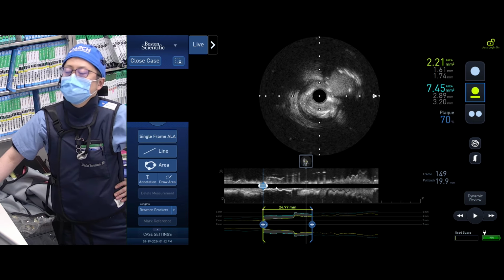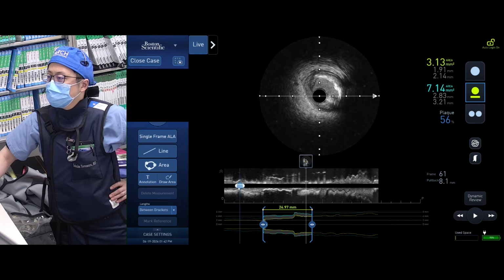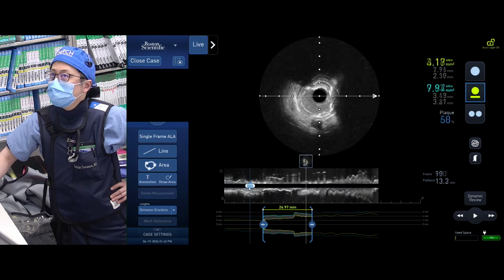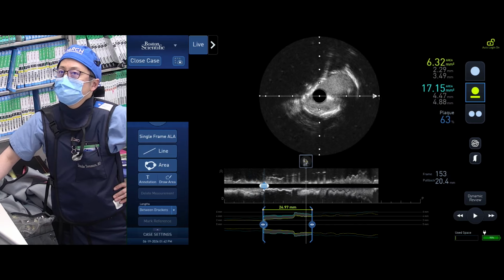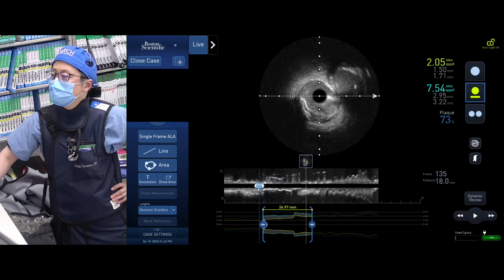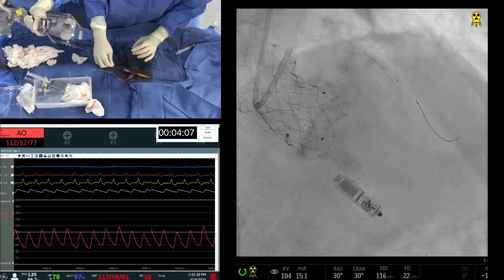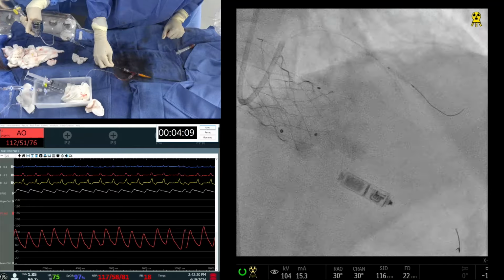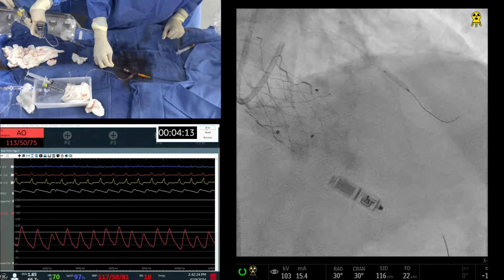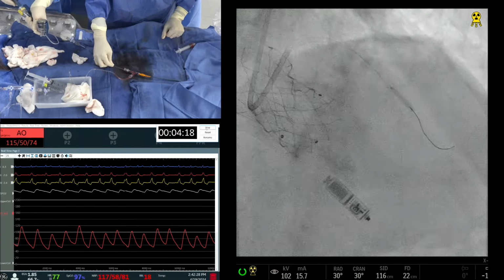It also appears on your IVUS that you got a little bit of an impact with that smaller intravascular lithotripsy and the proximal ID too. Yes. The IVUS at the bifurcation is so much better than what you did proximally. You did something to the calcium, and you don't really have that much attenuation now because you modified the calcium and you cracked it with lithotripsy, not only superficial, but deep. And that's why your imaging improved. Very good illustration.